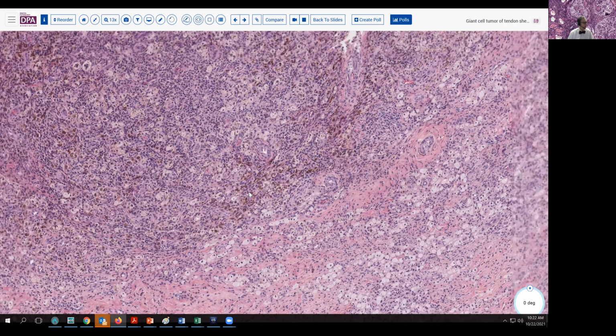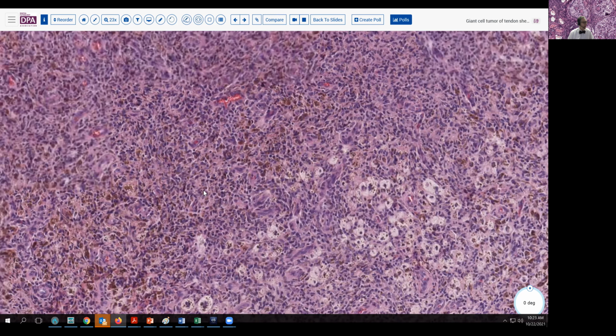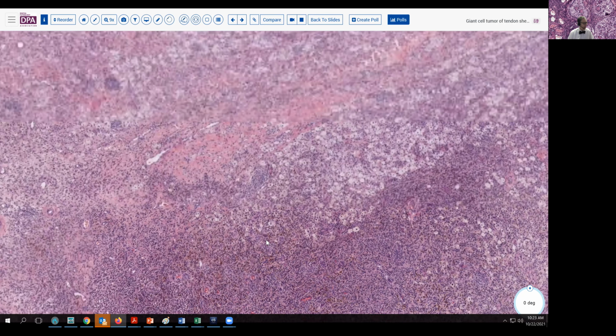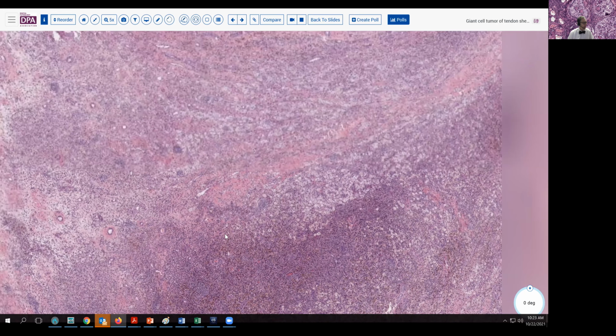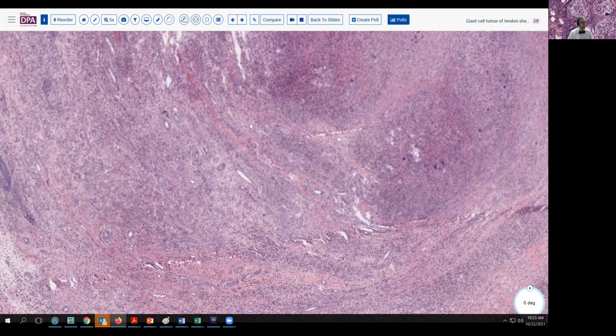Looking a little bit further, we see that some of the histiocytes contain this pigment. Of course, pigmentation always raises consideration of melanoma, and if that was a serious consideration or a history, we might do various stains for melanotic markers. Here again, you can see more histiocytes in the background, vague vasculature.